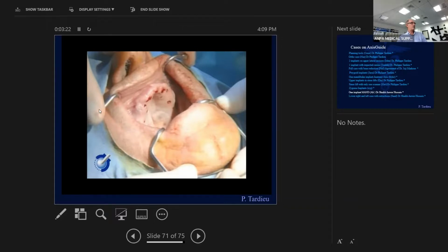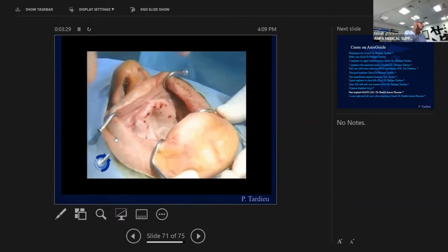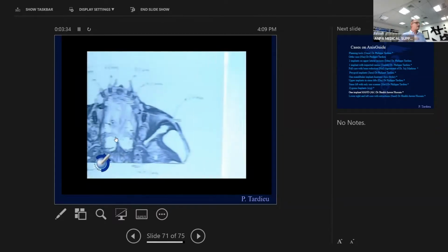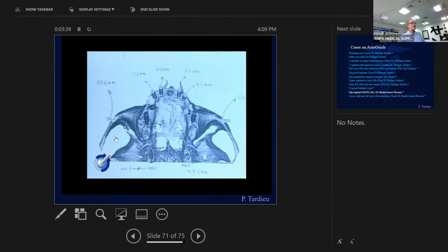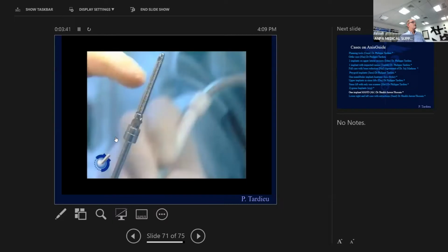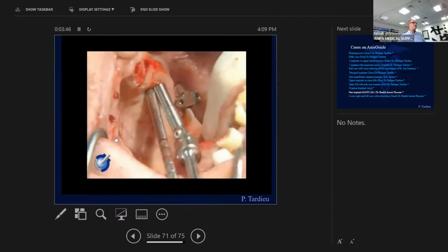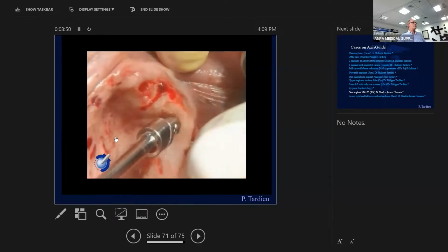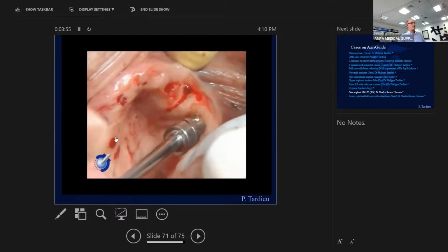After, we take an impression, and the day after, we place the bridge. So this is what I wanted to show you. We take impression. So we've been planning all that. This is the plan. The Zygoma eminence on right and left side, the Pterygoid implants, the implants. Okay, so these implants were Nobel Biocare implants at that time. And we tighten strongly. This is the implant holder.